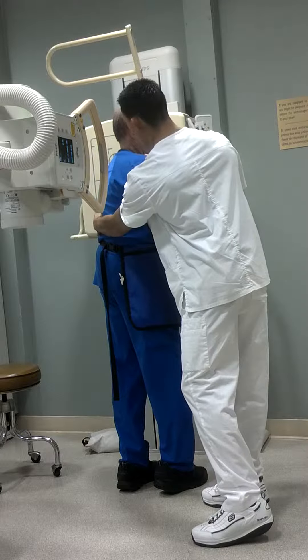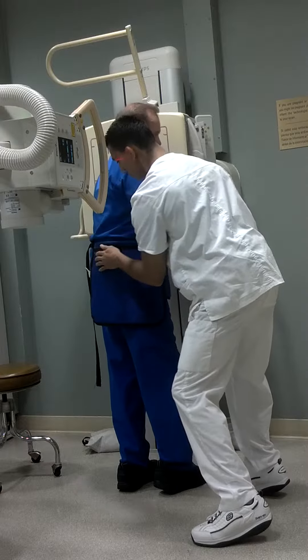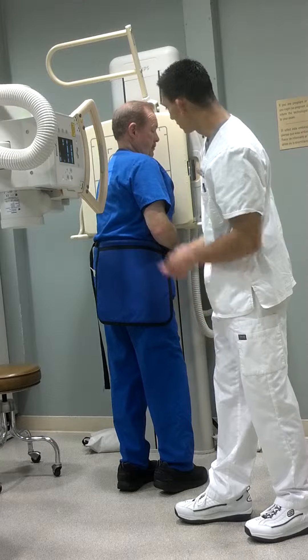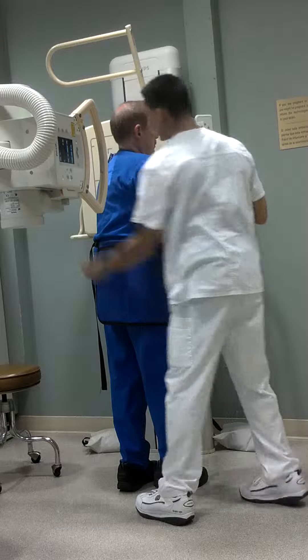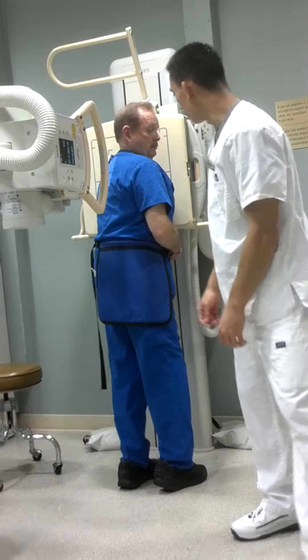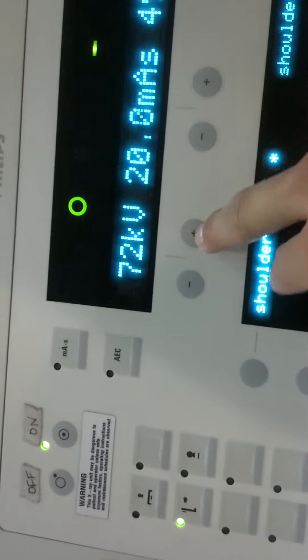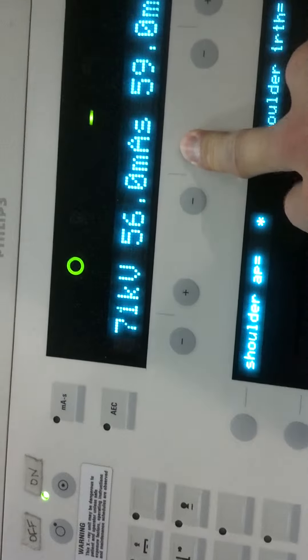Get a little rotation here and turn the shield this time on that side where the primary beam is coming from. Get our marker in here — got the left marker in there — and it looks like we're all set to go, so we'll come over here to the console. I'll be shooting this Bucky at about 71 kVp and about 50 mAs on this console.